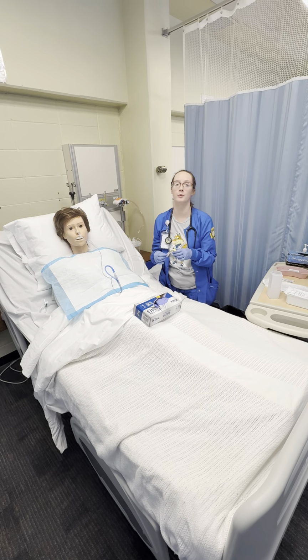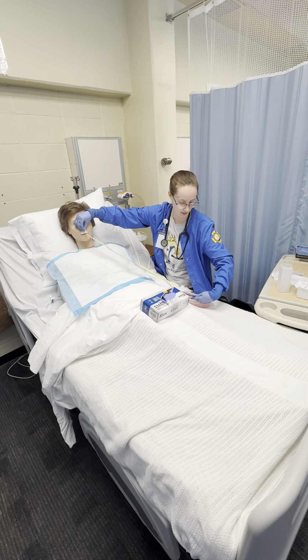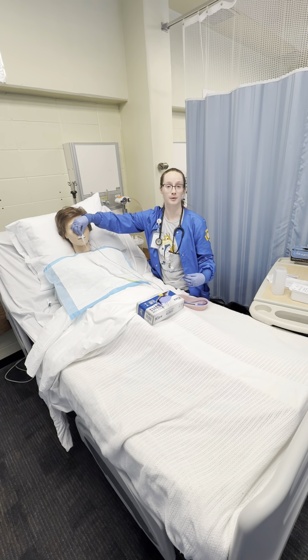And we're going to measure all the way down to the end of this tubing here and not include the aspirating end. And so for the sake of the video, because the NG tube wouldn't go all the way into the mannequin, it's a little longer for us to measure. But I would typically just go ahead and measure the exposed tube, and I would take that measurement and I would document it.